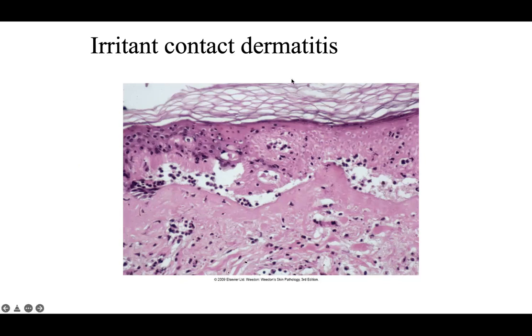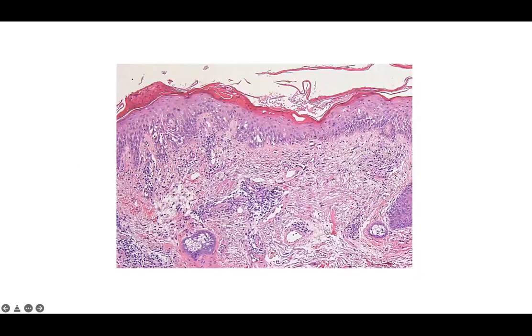Now, not all irritant contact dermatitis looks like this. In fact, this looks a lot like nearing a Stevens-Johnson or toxic epidermal necrolysis because it's full thickness here. But look to the left, you'll see a demarcation of where that irritant contact really had its effect, because there are pretty close to viable keratinocytes over here. The nucleus is still intact, at least on the left. Some more examples of some direct toxic effect in the background of spongiosis.